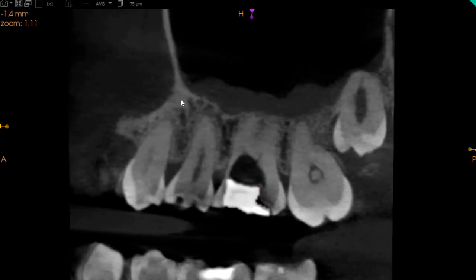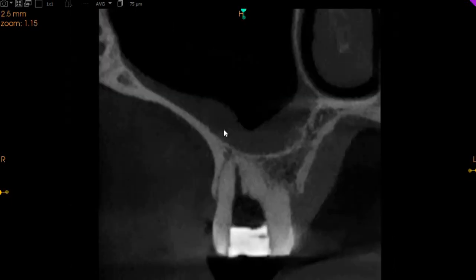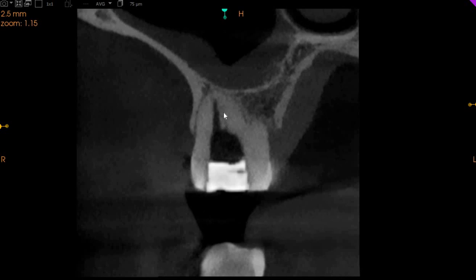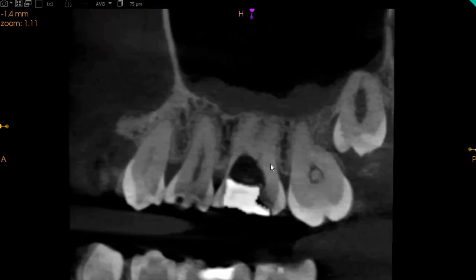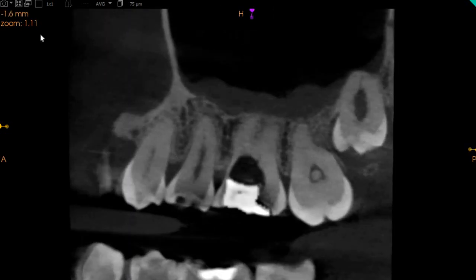This is the MB1 and this is the MB2 right there. There is a very good chance that the MB2 is sclerotic, and at this point you'll also be able to see that the MB2 merges with the MB1 — so there is no specific or separate apex that we can look at for the MB2. We don't see any major cracks in this tooth. This segment will also show you how close to perforation it is on the mesial aspect, so that is something that needs to be kept in mind. Thank you very much.